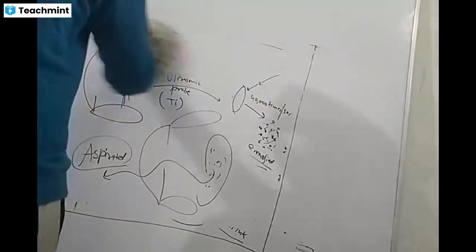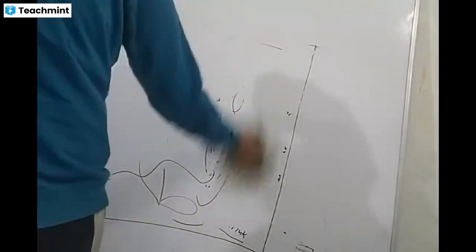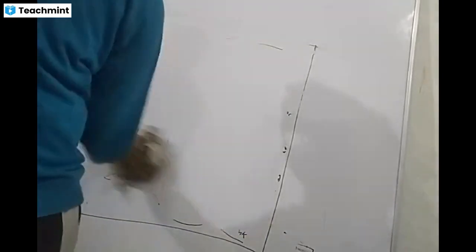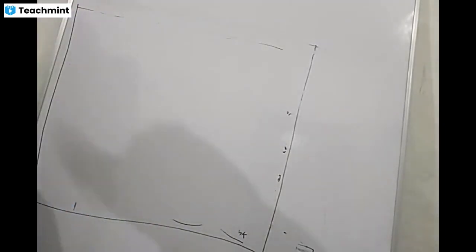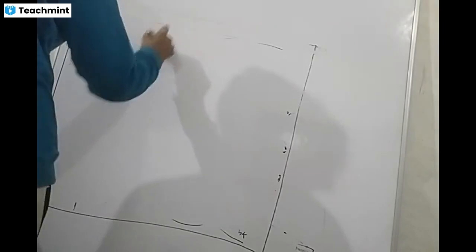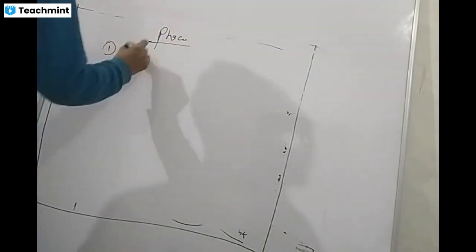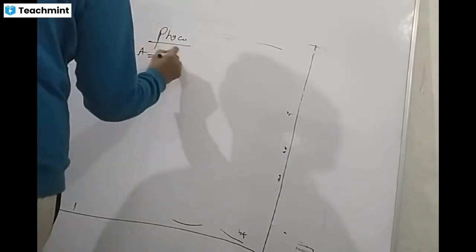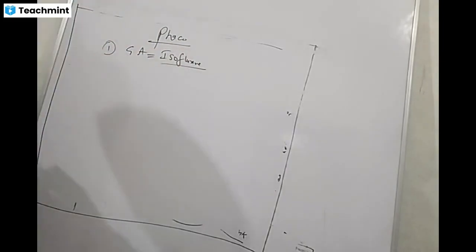How is this phacoemulsification surgery done? What are the steps? How to enter inside? For phacoemulsification, first is general anesthesia. Use isoflurane, it is recommended.